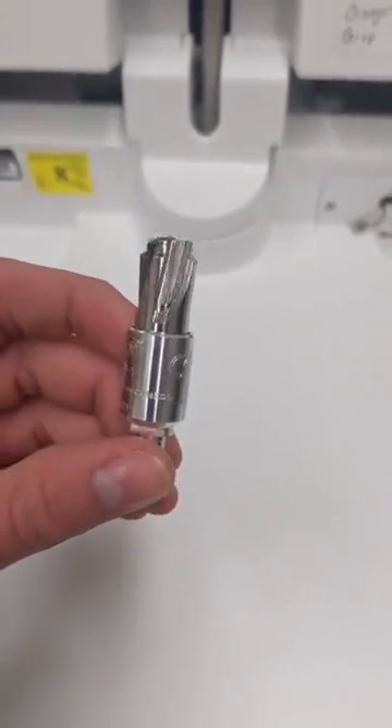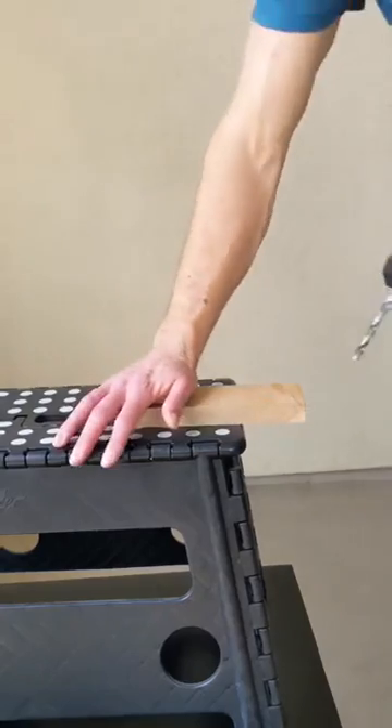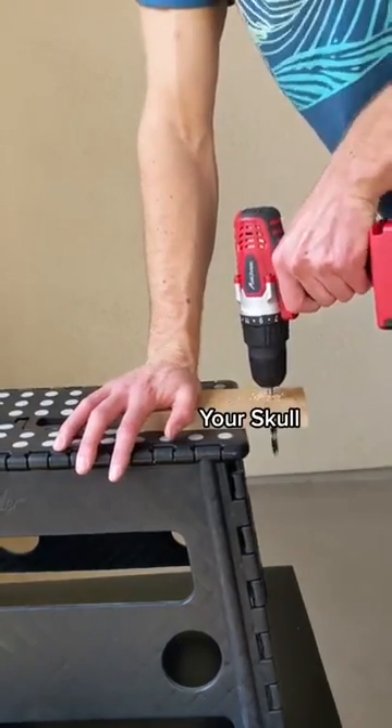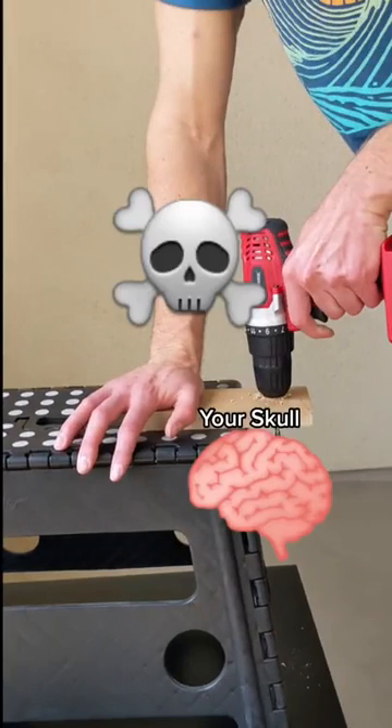If someone says drill bit to you, this is probably one of the first things you think of — something that you might find in your garage. This couldn't be used during surgery, because the surgeon could end up drilling too far, breaking through your skull bone, and going right into the brain.